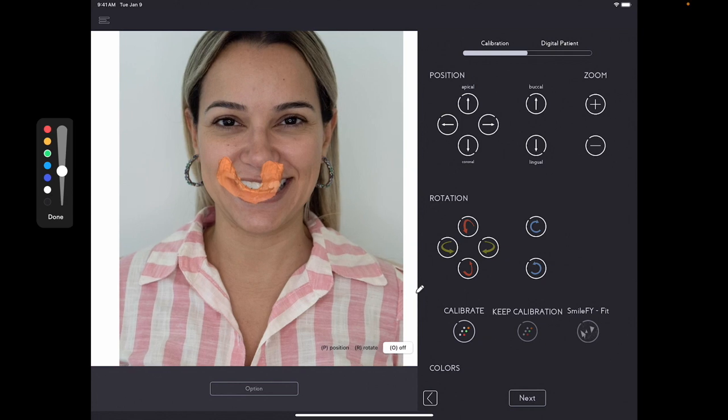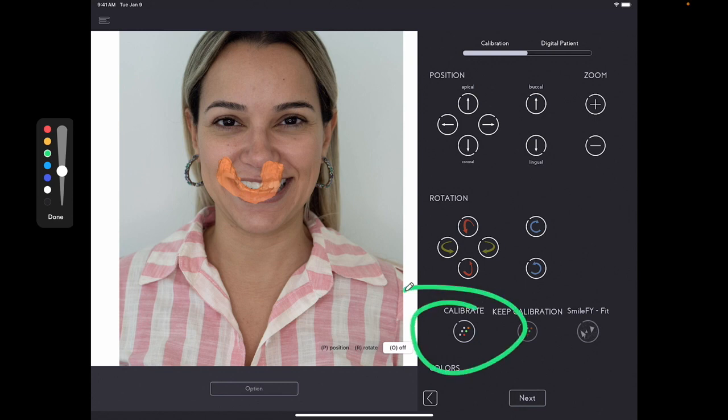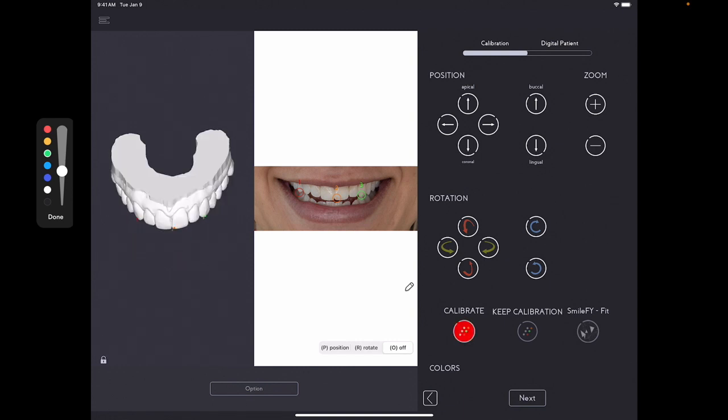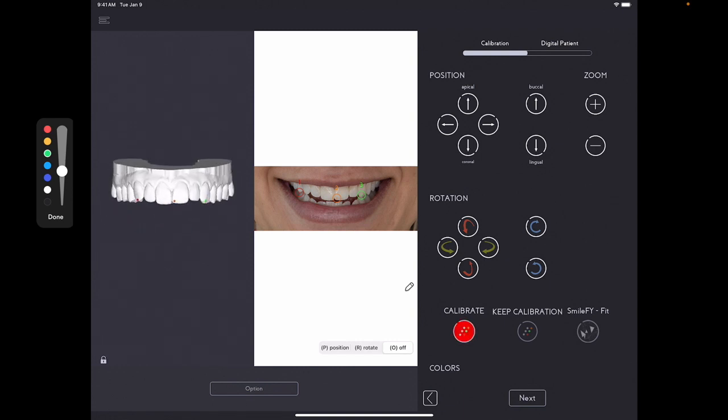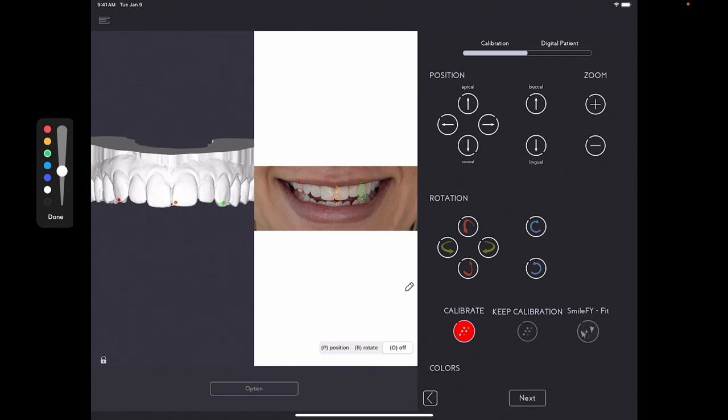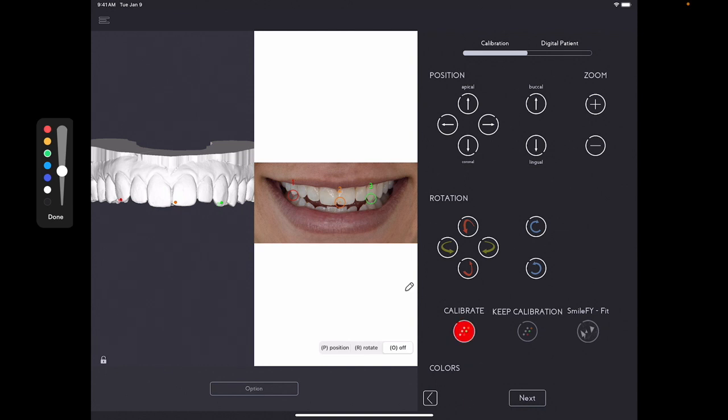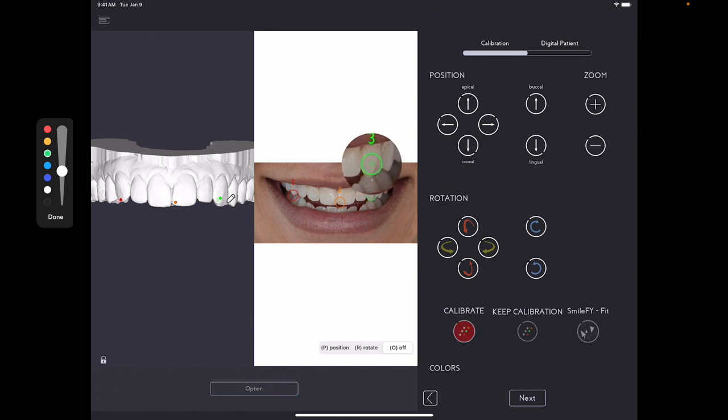Well, if that happens, it's good to happen here. If that happens, you can simply hit Calibrate once again. Let me unlock my file. Maybe I just placed the targets in the wrong position. You can click on the STL dot and maybe like bring a little bit close to the middle third. Same thing over here. And then you hit Calibrate.